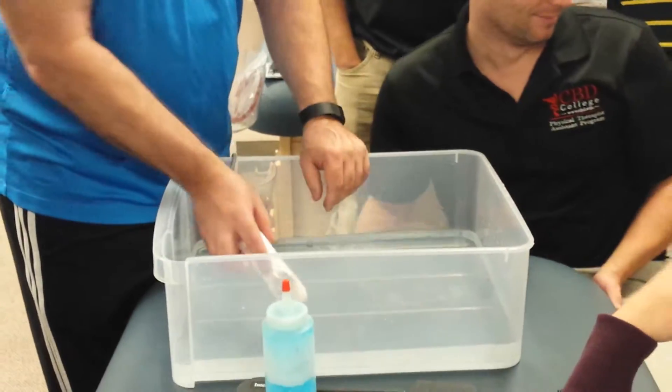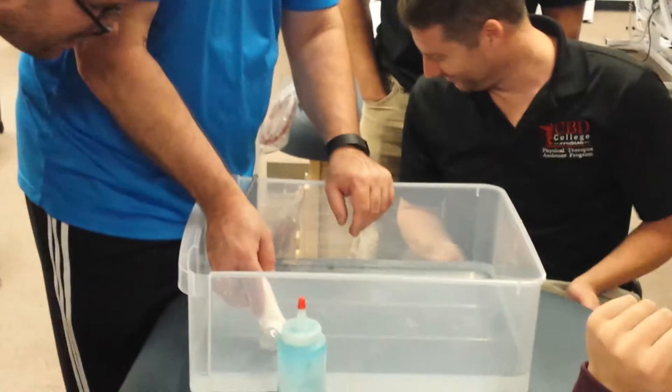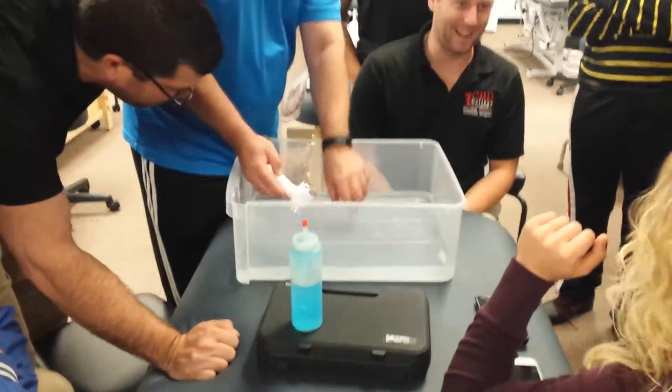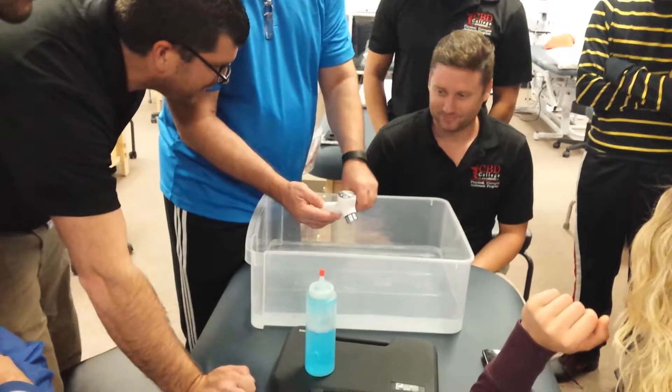Okay, so what you want to do with... you should see. I have actual pain. That's cool.